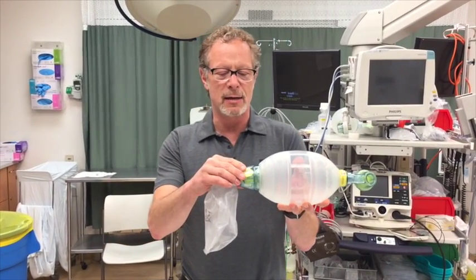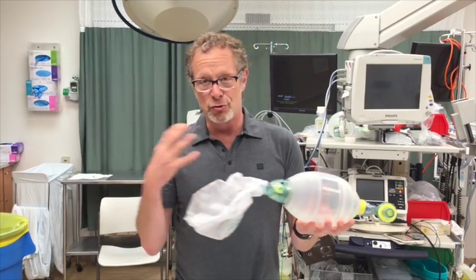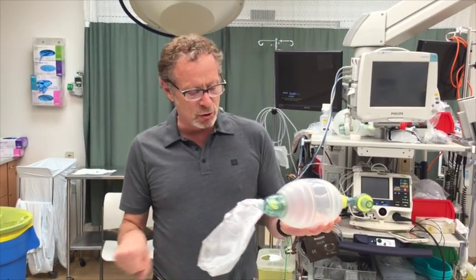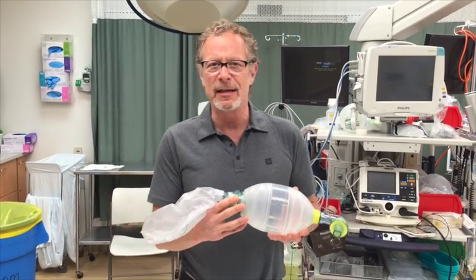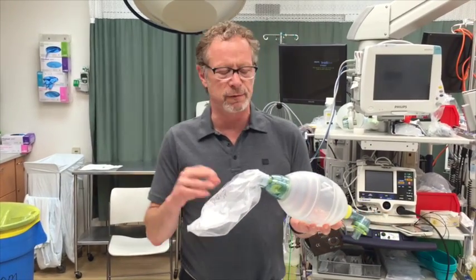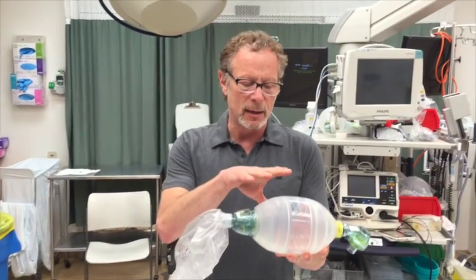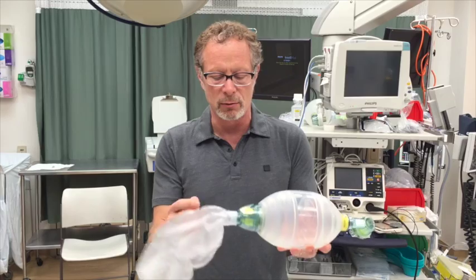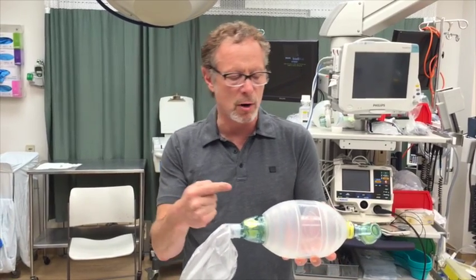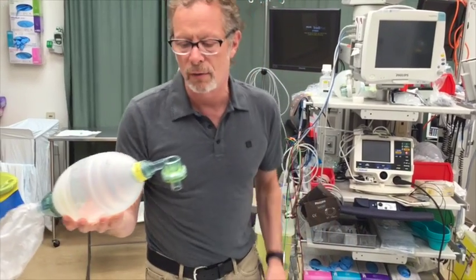One is an air intake valve, meant to entrain air in case you have the patient hooked up but you're not supplying any oxygen. It also has a safety outlet valve in case you're providing too much flow. Then you have a one-way valve between the reservoir bag and the manual bag to give one-way flow from the reservoir to the front of your system.